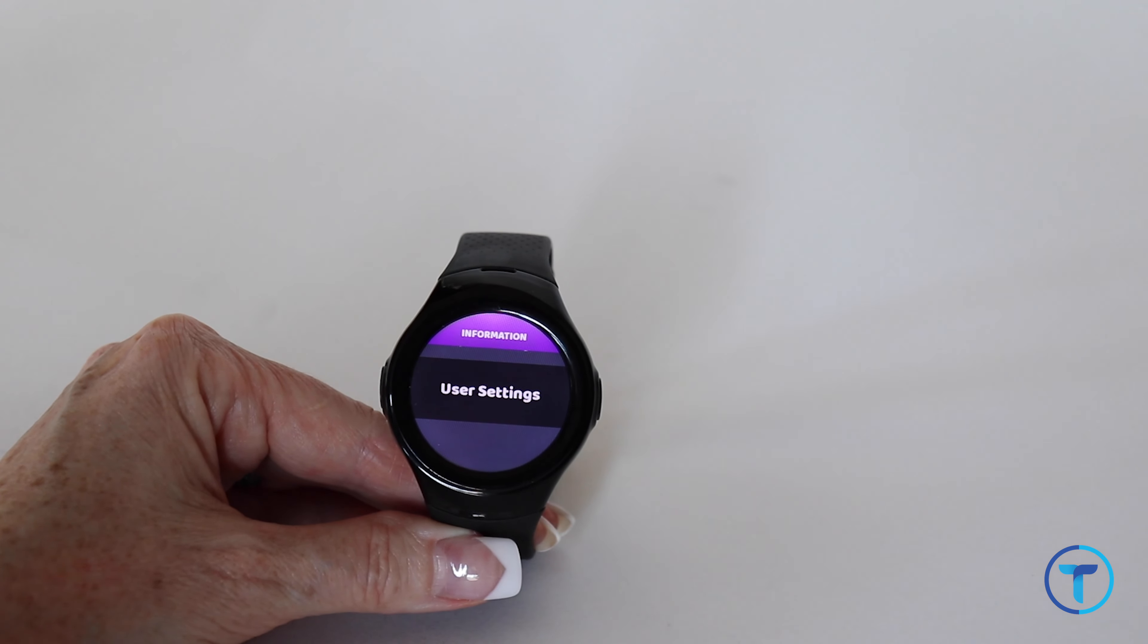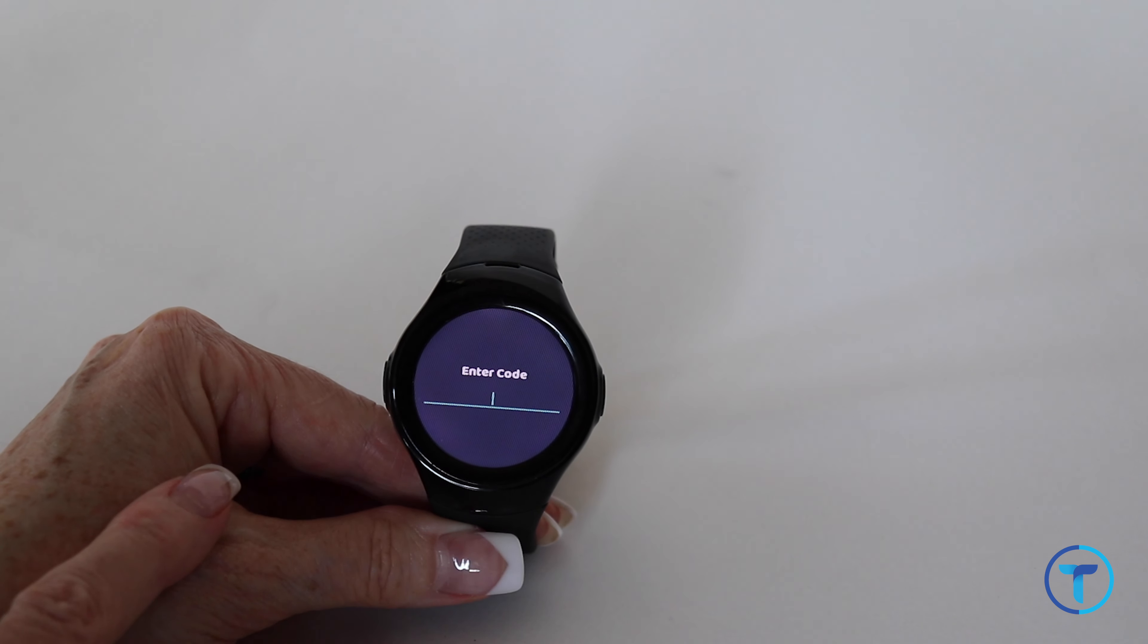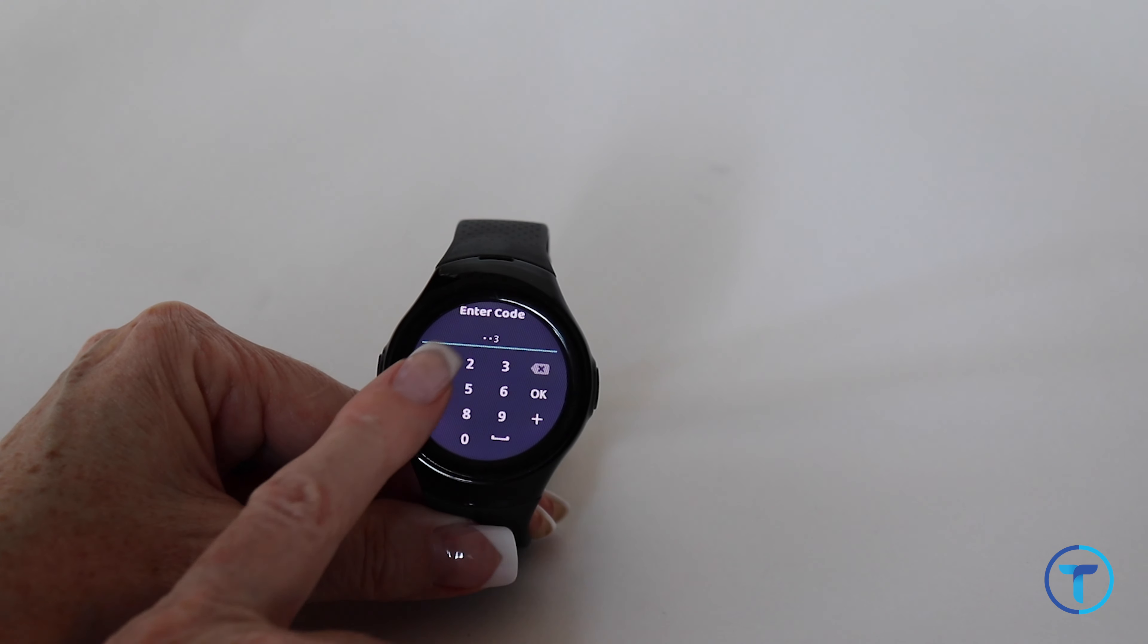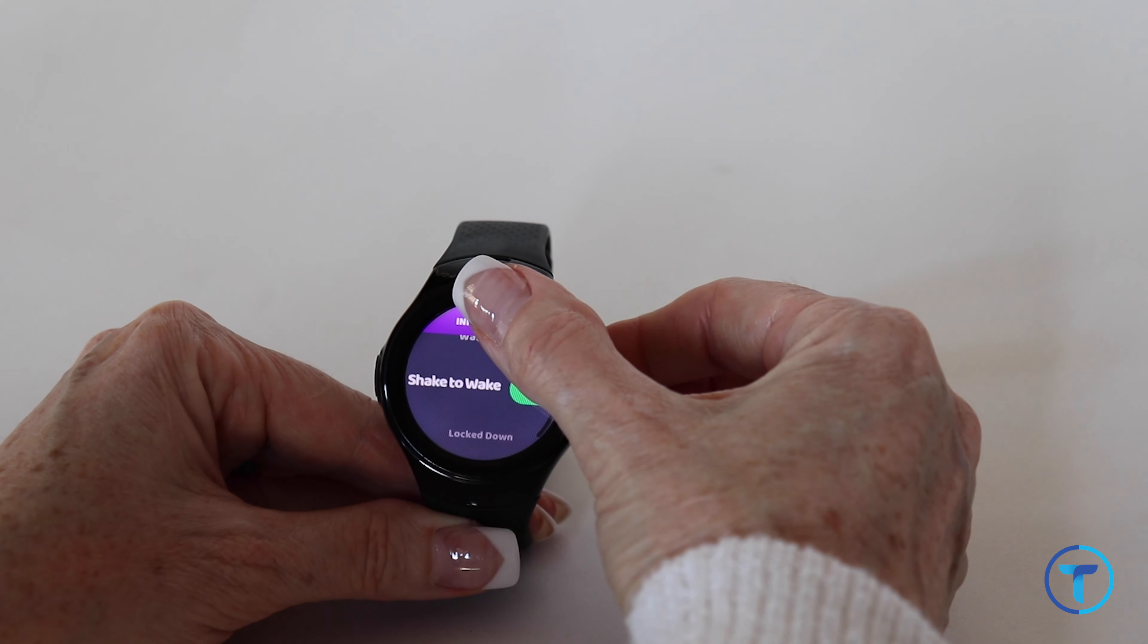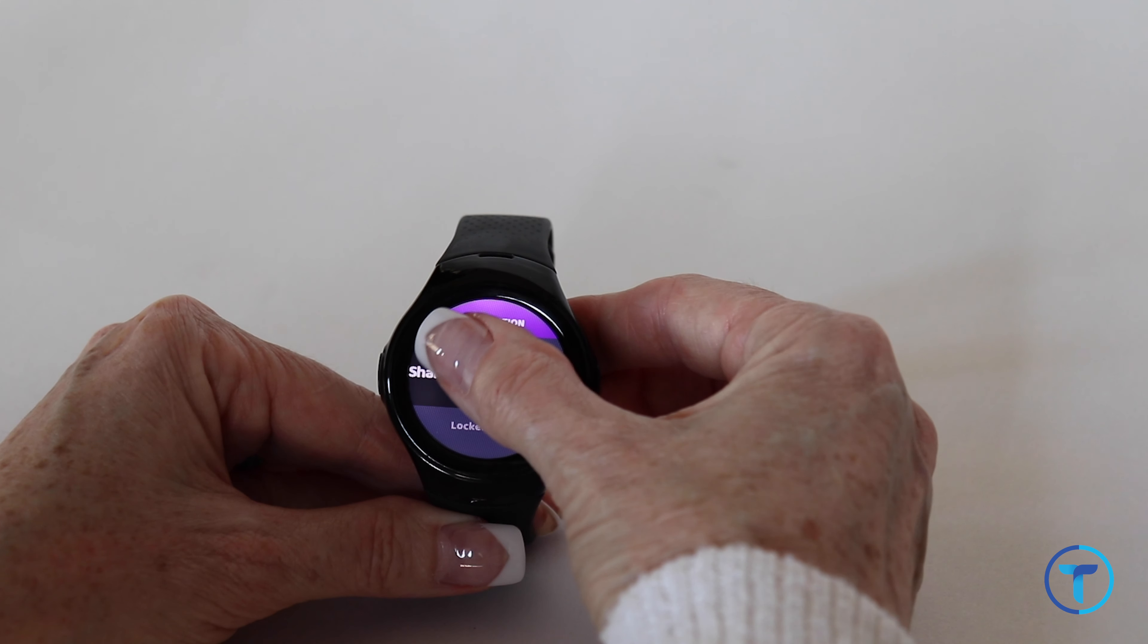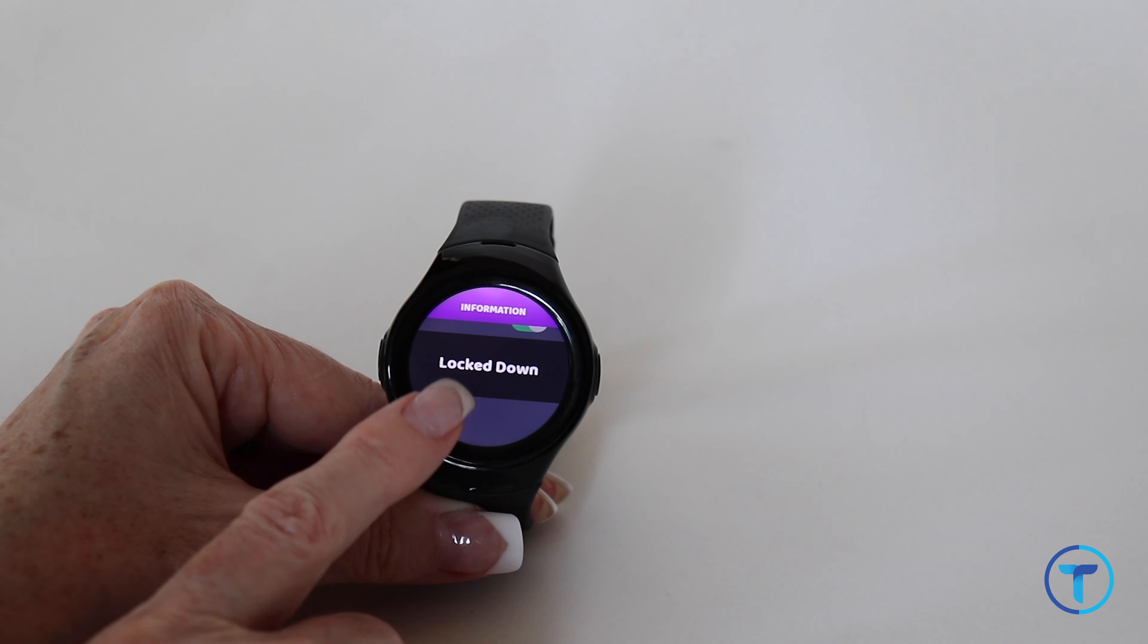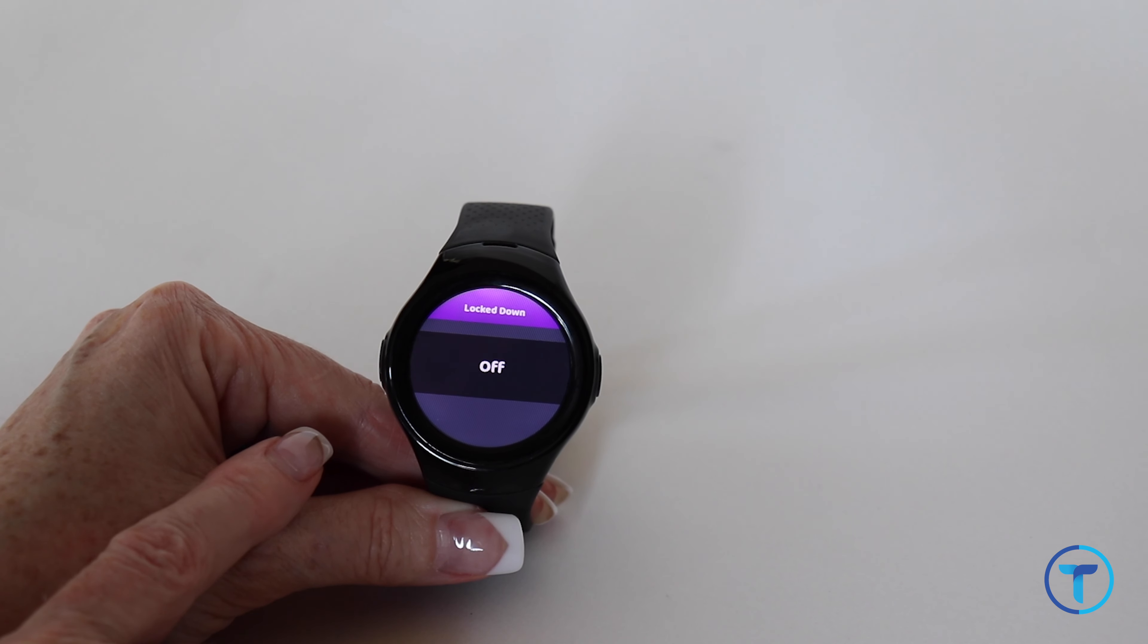Tap on User Settings and enter the universal passcode of 1234. This is also where you can change the watch face. Turn on and off Shake to Wake and then you get to Lockdown. Tap on Lockdown.